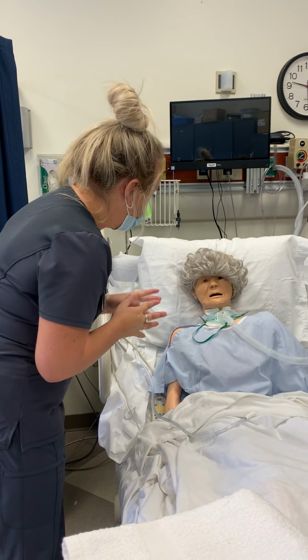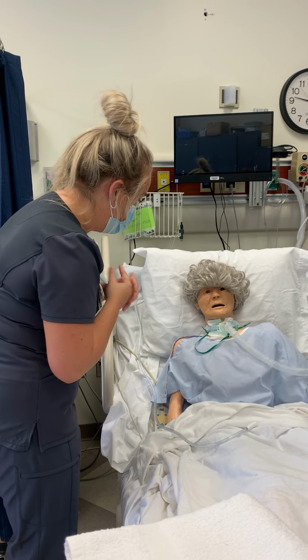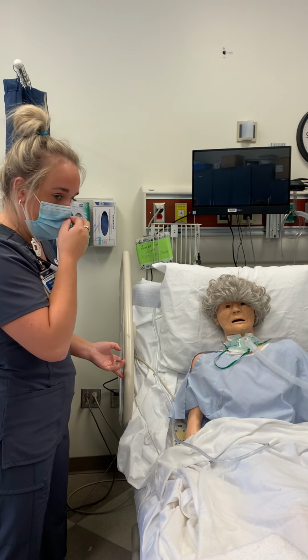Mrs. Smith, while I'm suctioning you, you might feel a little bit of pain or feel like you need a break or something. So if any of that happens, you can go ahead and just raise one of your hands and we'll give you a break, okay? Okay. So I'm gonna raise her up to my height. I'd make sure to provide privacy, everything like that.